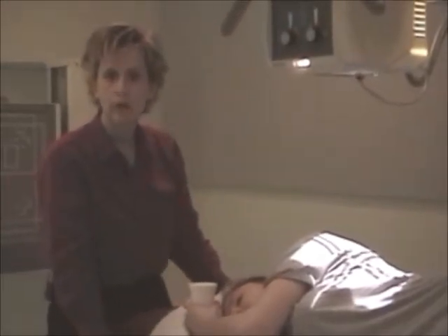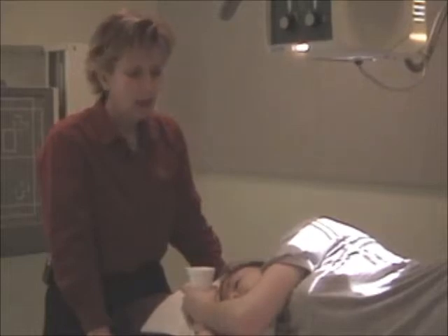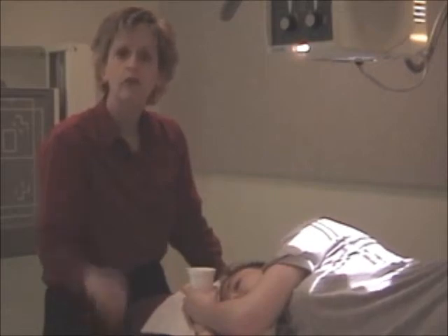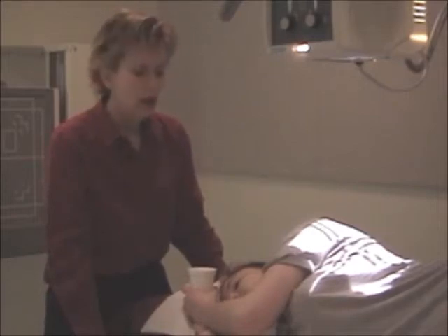Let them know that it's important for them to take big swallows, since it is difficult to catch barium in the esophageal tract. Have them take about 4 swallows and make your exposure if you can see the epiglottis go up, or you just hope luck is with you if you can't see the epiglottis go up. You might do other obliques, but again, if you remember the film's edge is level with the mouth and the esophagus is anterior to the spine, you'd be able to do any position that a physician would ask you to do for an esophagus.